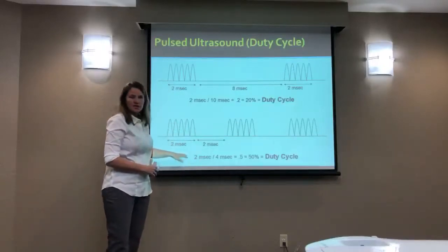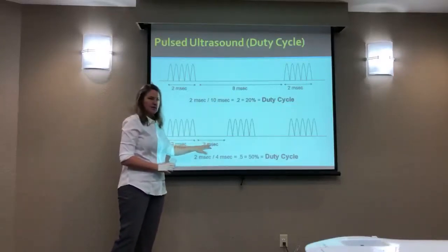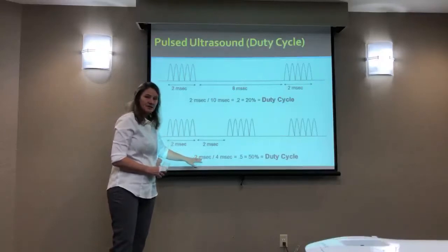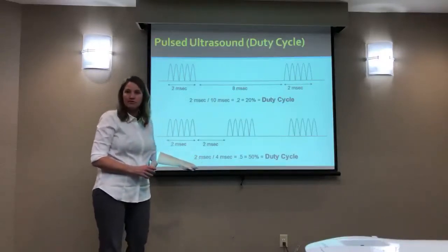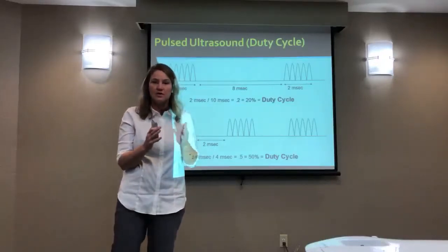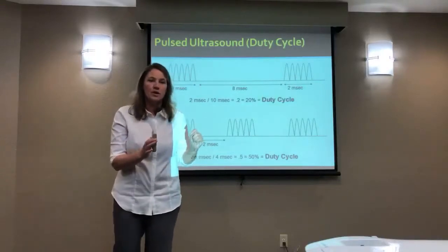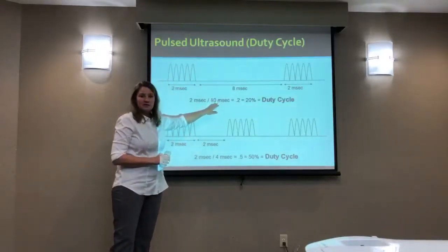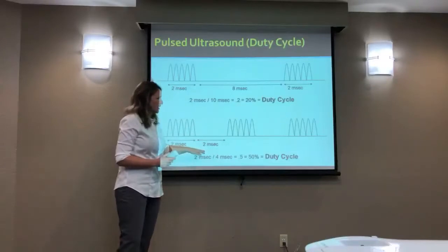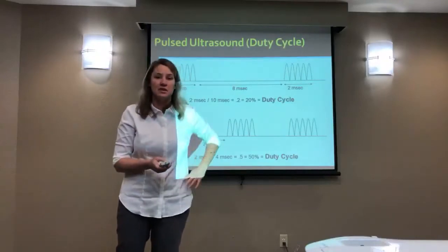Okay, a 50% duty cycle, just another example, would be off the same amount as it's on. So if it's on 2 milliseconds, it'll be off 2 milliseconds. On, off. Same idea. Your chances of having a buildup of heat are better with 50%, but still not likely if you have good vascular tissue. 100%, which is continuous, is what you want to use if your goal and intention is to heat up the tissue. Go with continuous, 100%. It's on all the time. If you don't want heat, most typically we're going to use 20%. I haven't seen a lot of research studies using 50%. Certainly you could use 50%, it just wouldn't necessarily reflect a lot of the research studies I've read. So I'm not sure what you would be using it for.